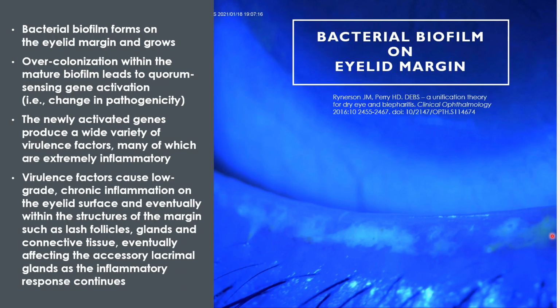This is that patient, and realize, when I saw her in September, I didn't put it on there. I cleaned her lids, I scraped them, I did the BlephEx blepharo exfoliation, and she still had this greasy looking filmy lesion where the biofilm is forming right here on the eyelid margin. I'm like, man, that stuff has reformed already. I mean, it's just been 2 to 3 months, my Lord. So her eyelids were all kind of nasty looking on the margin again. So I went at it again. I cleaned it off again.